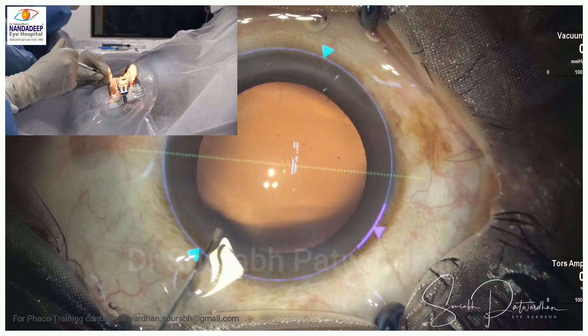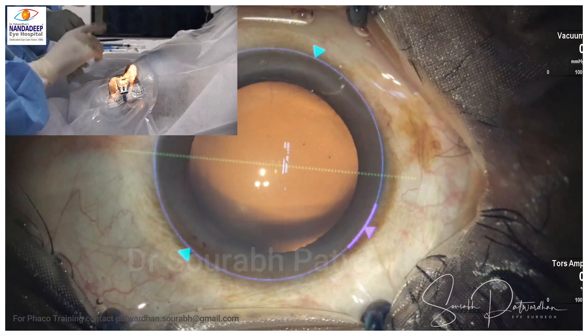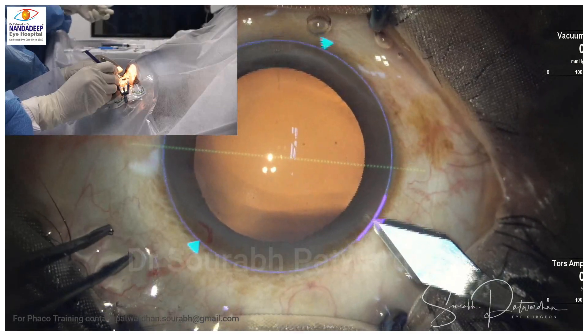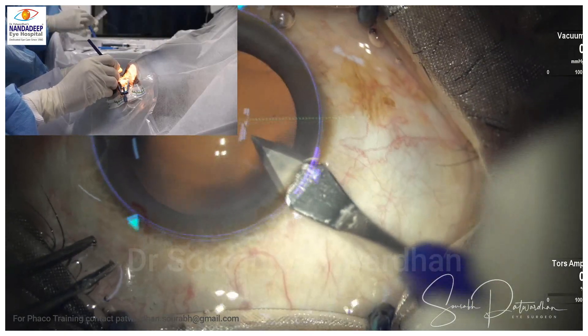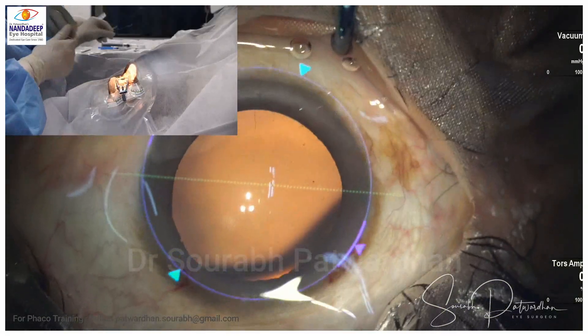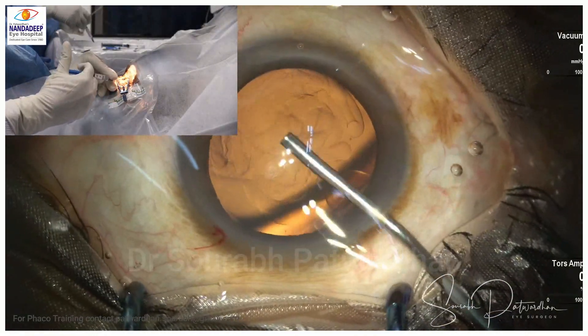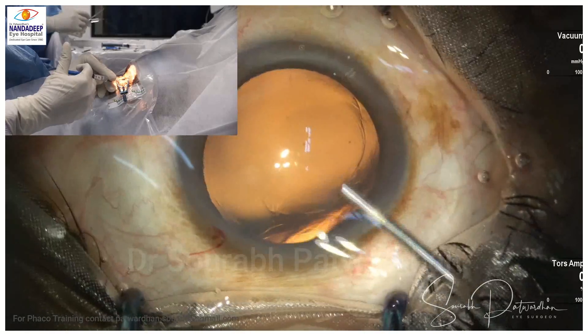In this video I will be showing a few things which we have to observe. I have previous videos also on hand movements, so watch this one carefully as well. Here I will be focusing on how the plane of the hand changes during different steps of the surgery.